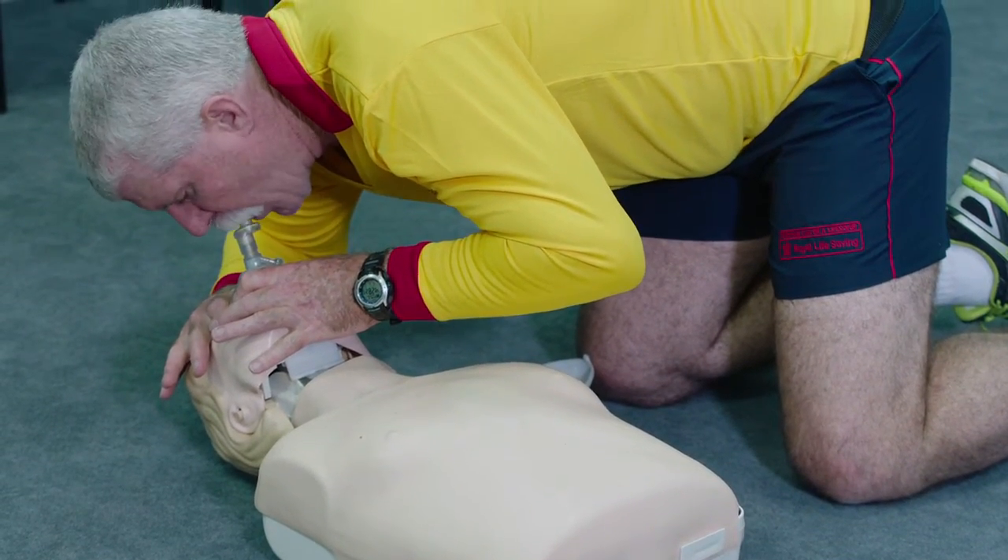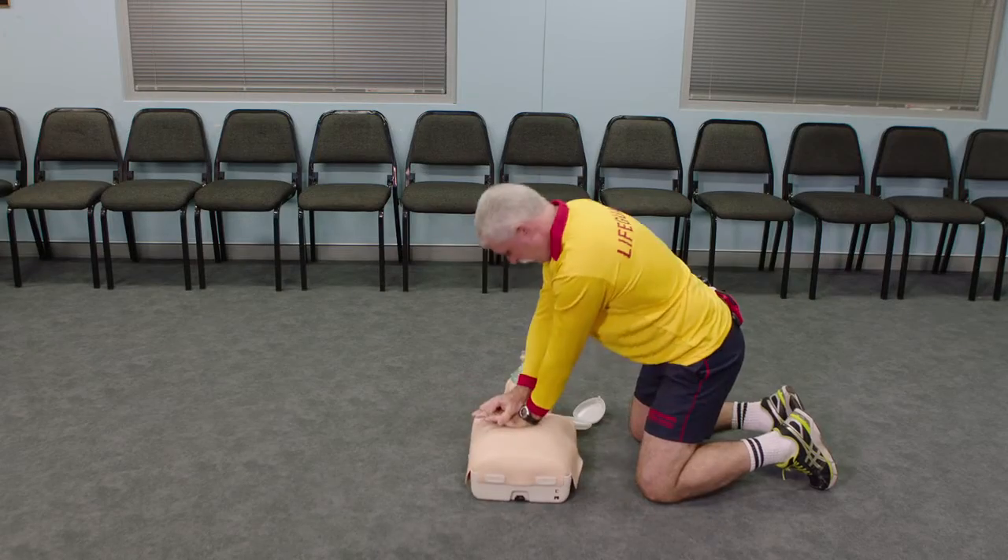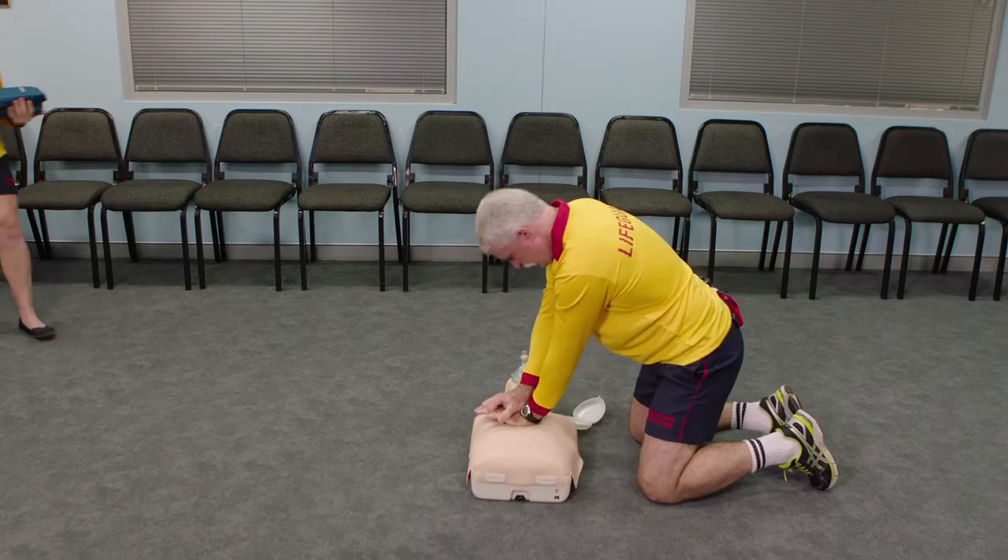A defibrillator should be attached as soon as it is available. On an adult, there should be no pause to compressions when attaching a defibrillator.